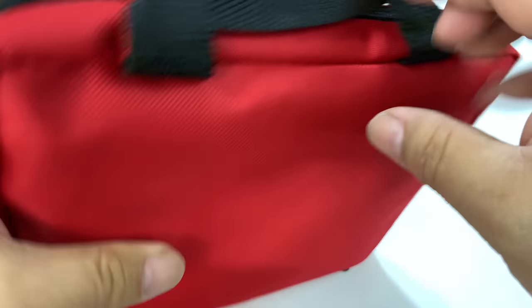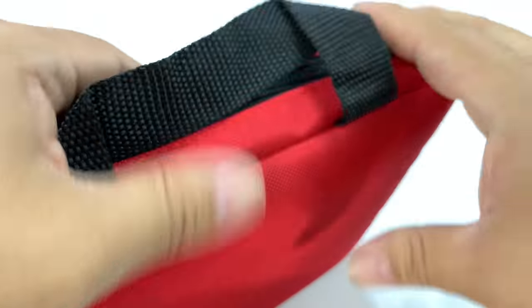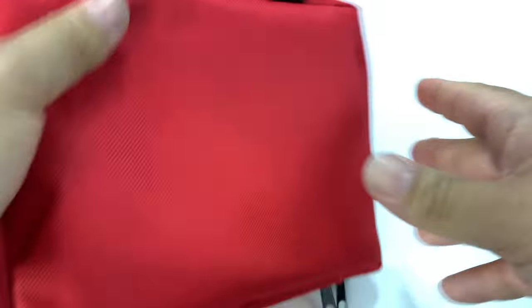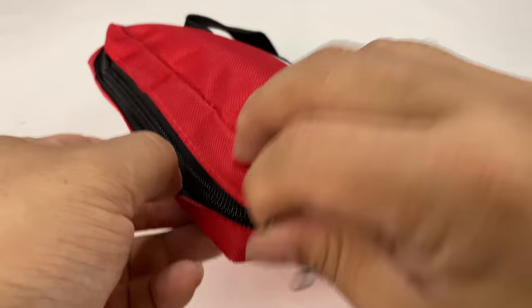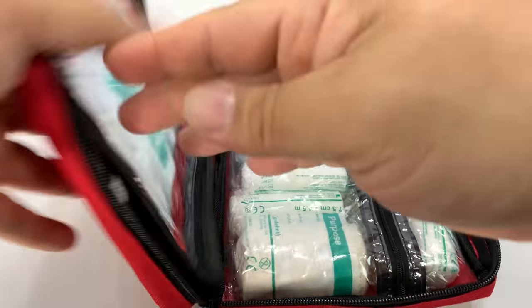What we have is a nylon pouch — kind of a low-end, not a full cordura or anything like that — but a nylon pouch with handles. Pretty nice. It says 'First Aid Kit' on there and it's by BodySource. Dual zippers. Let's go ahead and unpack this and see what it comes with.